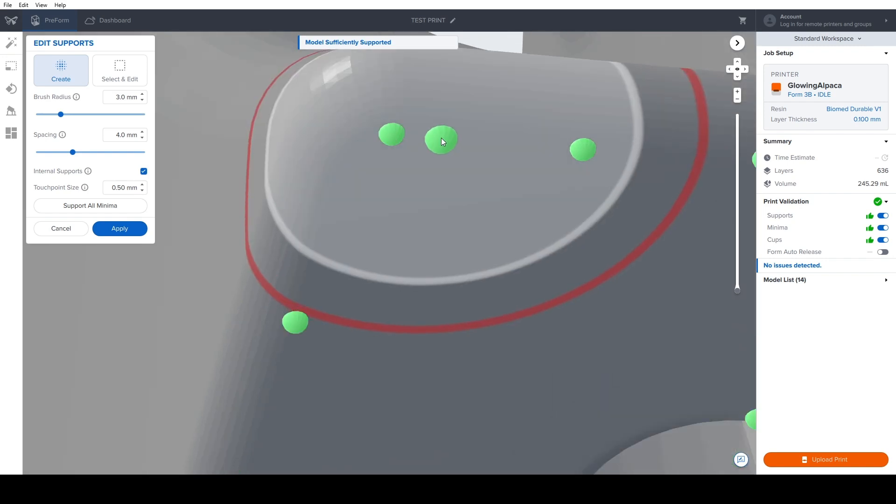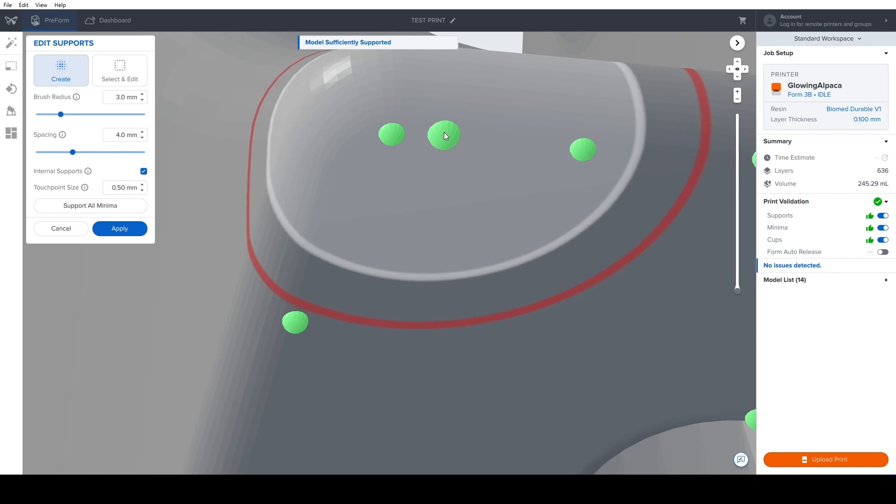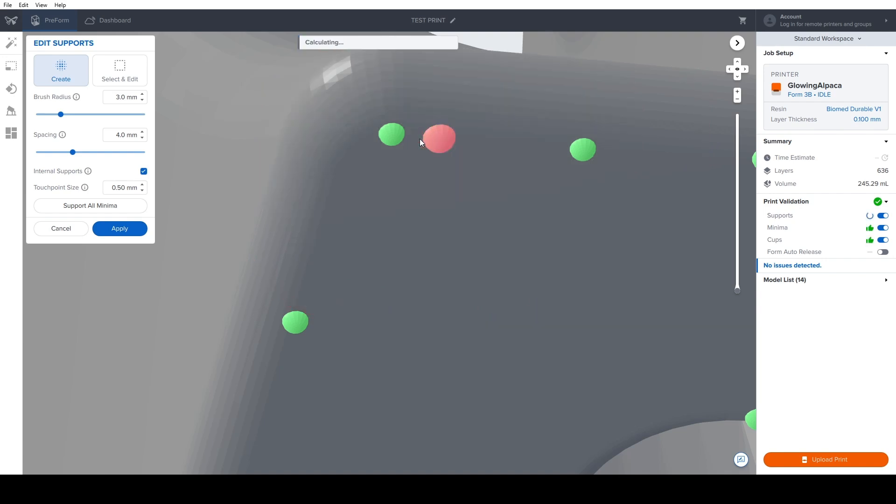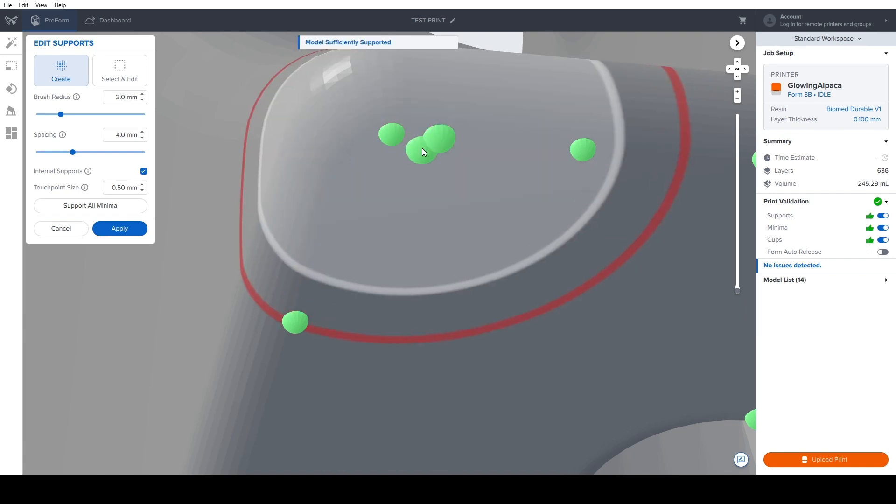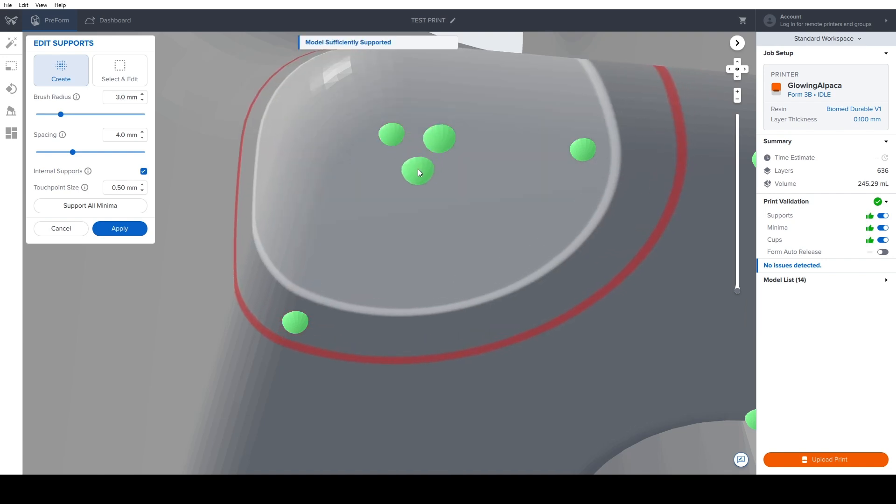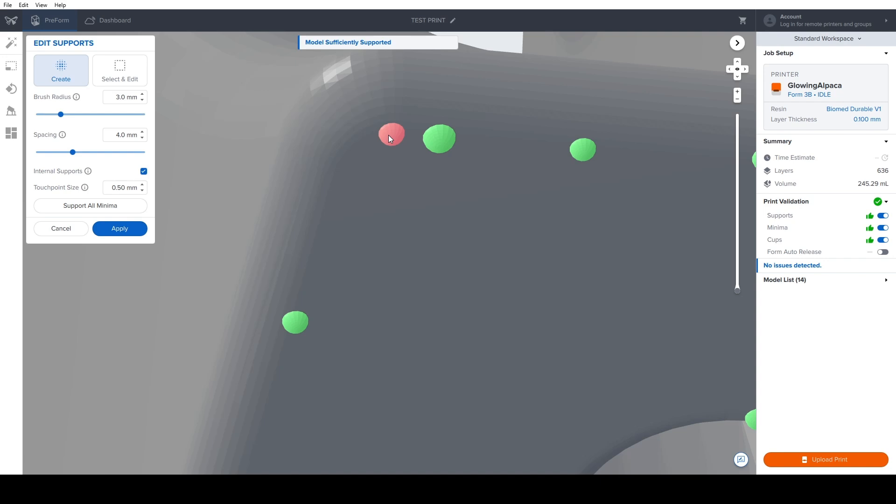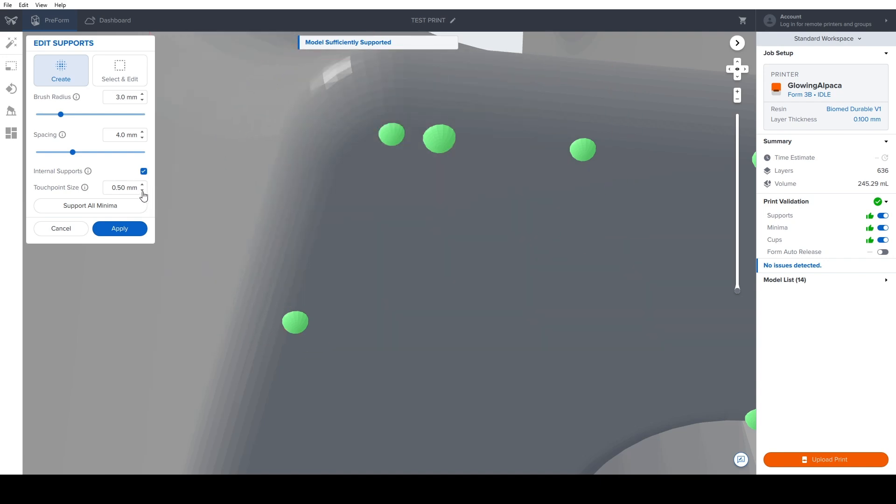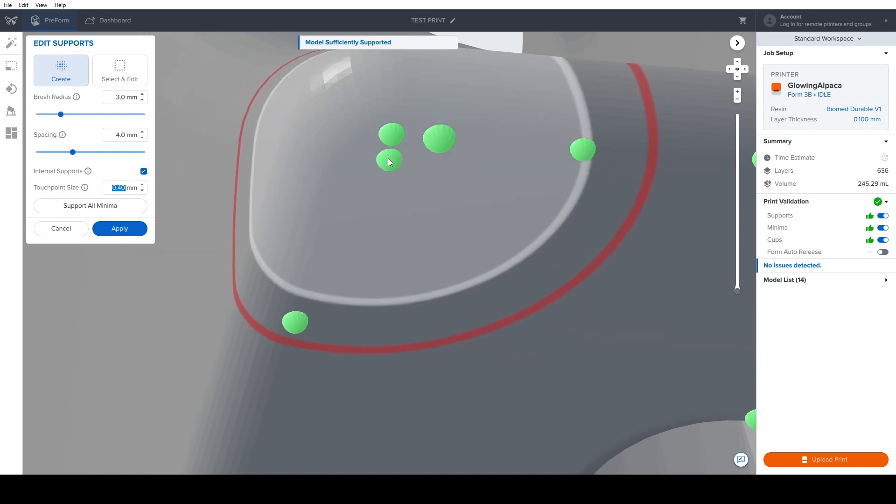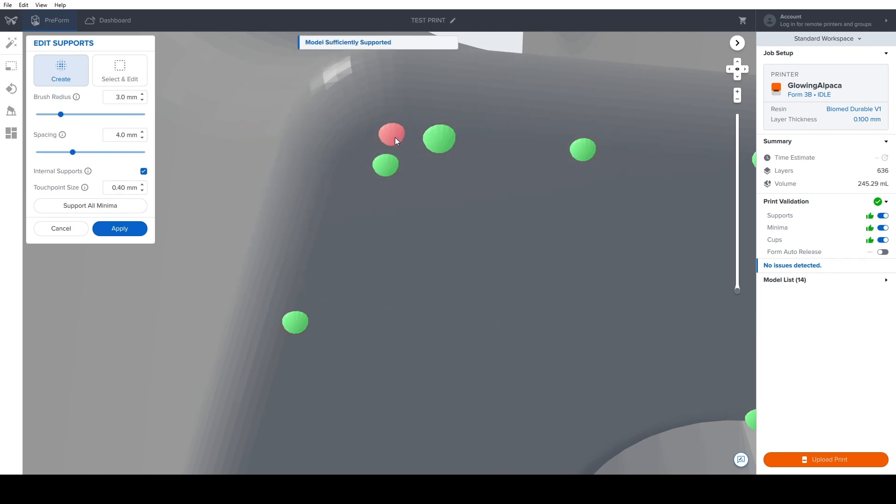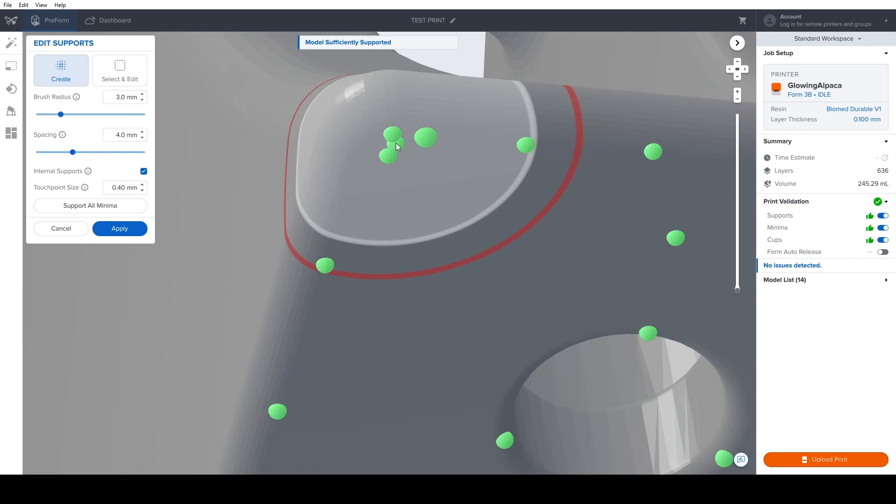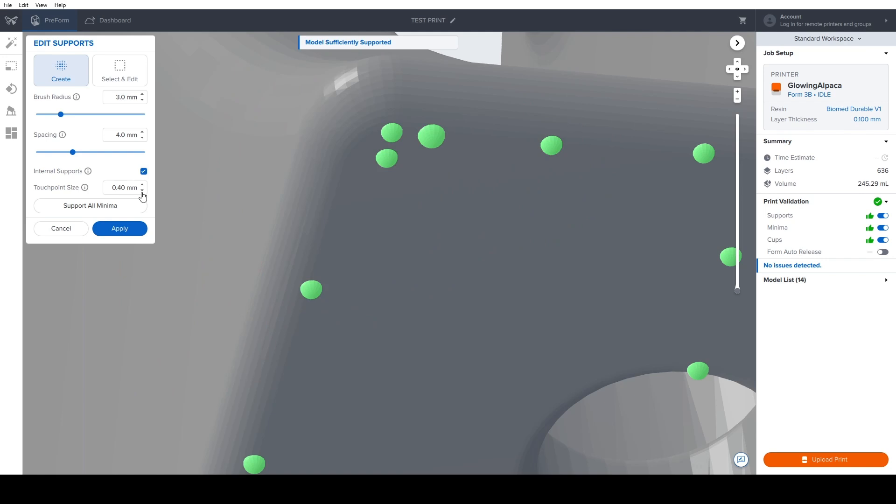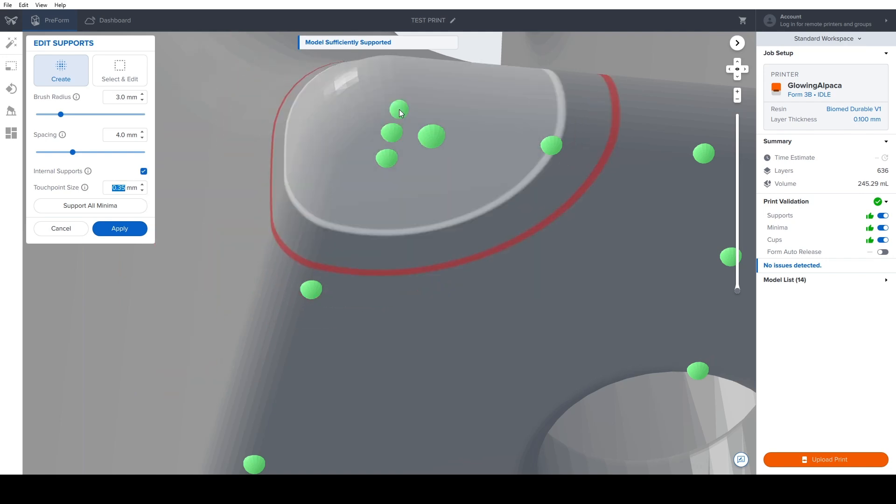So by default, Biomed Durable is a 0.5 millimeter touchpoint size, which is this guy, this big guy here. And I'll just place one there next to the support sizes that we already had. And I believe that is a 0.4 millimeter. Yeah. So instead of 0.5 millimeters, we typically go down to 0.4. With durable and flexible materials, you can actually go down even further to 0.35.